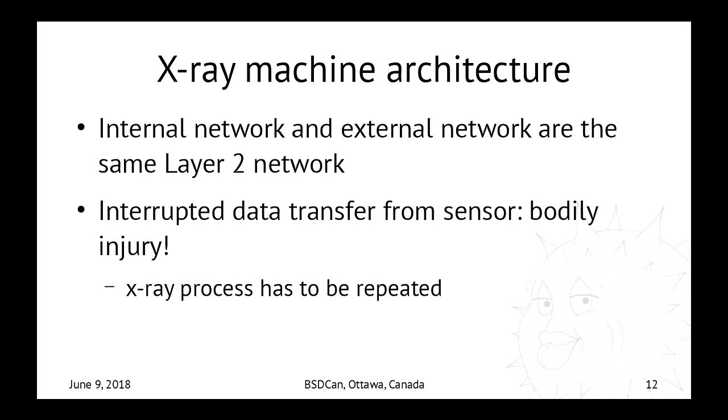So we often work in environments where an interrupted data transfer is annoying and you don't want this, and the customer has to click download again or click whatever again. In this case, the consequences are actually worse. If the data transfer between the image sensor and the imaging station is interrupted, this is considered bodily injury because you have to redo the X-ray process. So there better is nothing interrupting the data transfer while the picture is being taken or the movie.